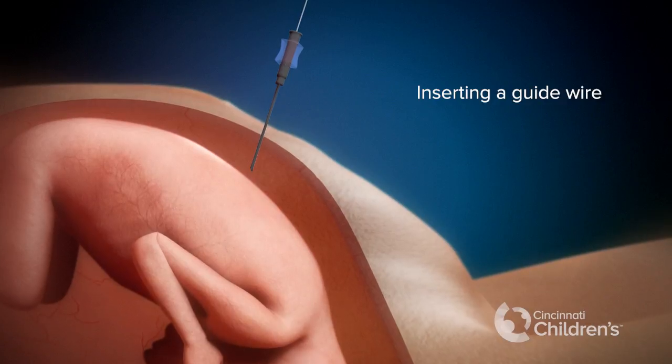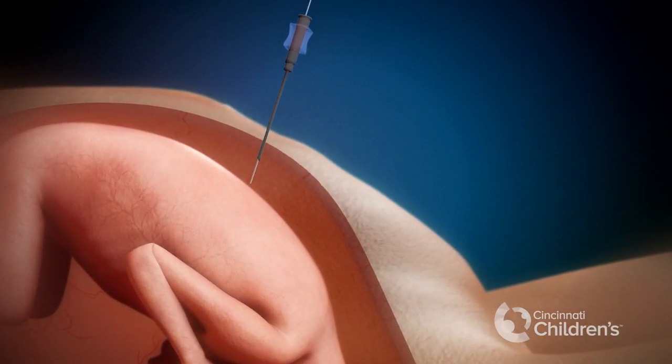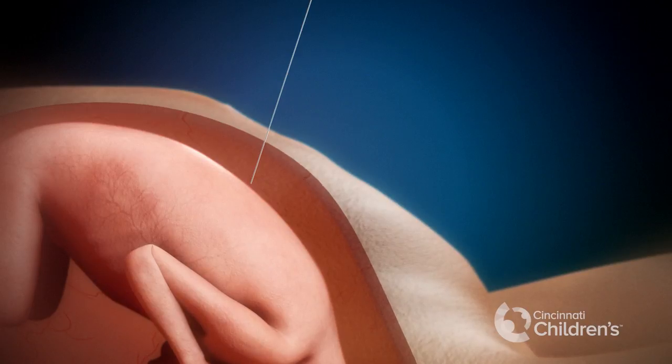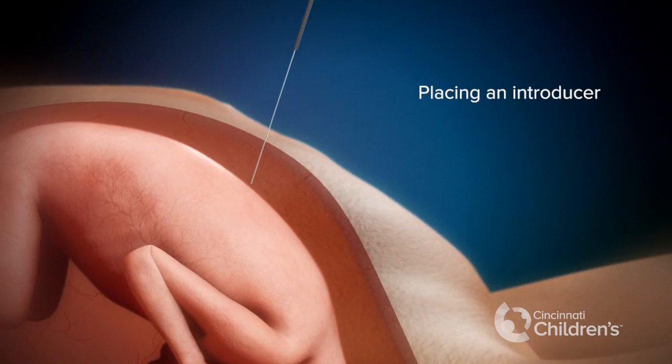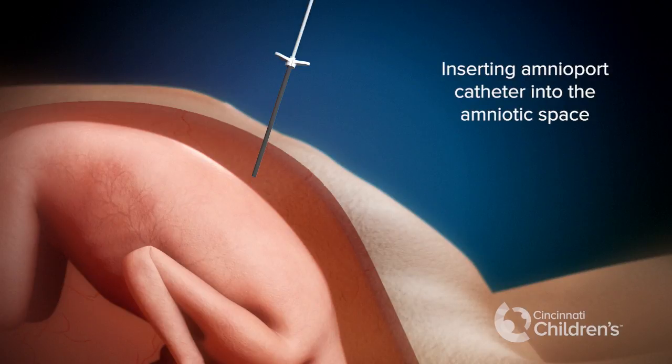A guide wire is passed through the needle. The needle is removed and an introducer is passed over the guide wire. Through the introducer, an amnioport catheter is threaded into the amniotic space.